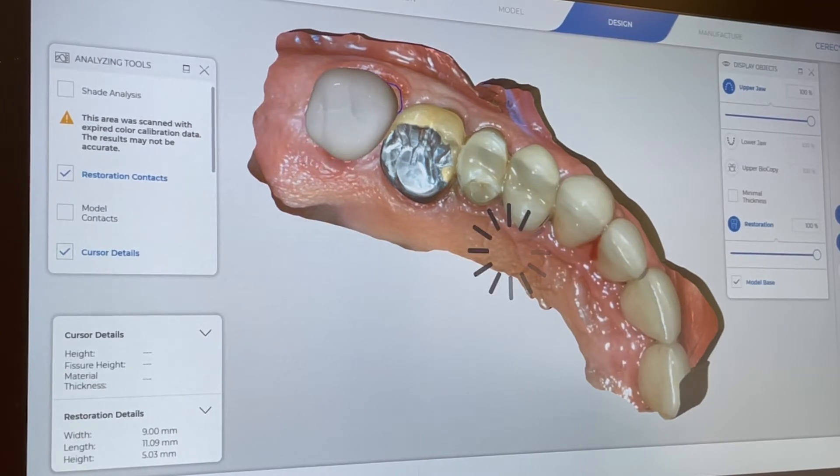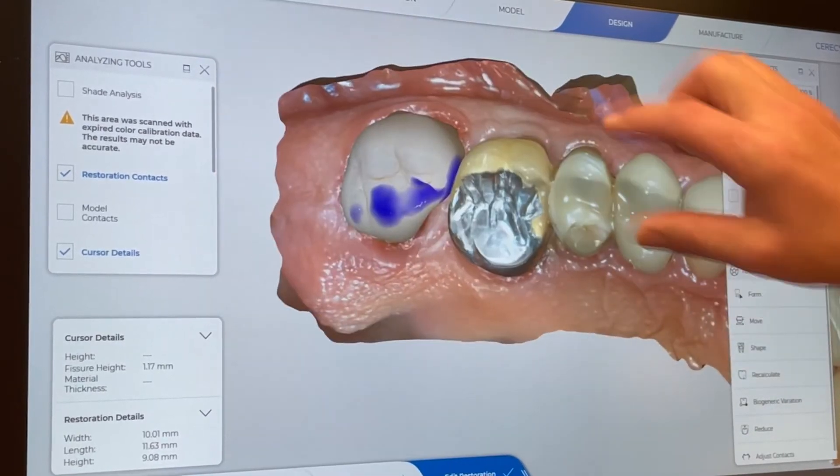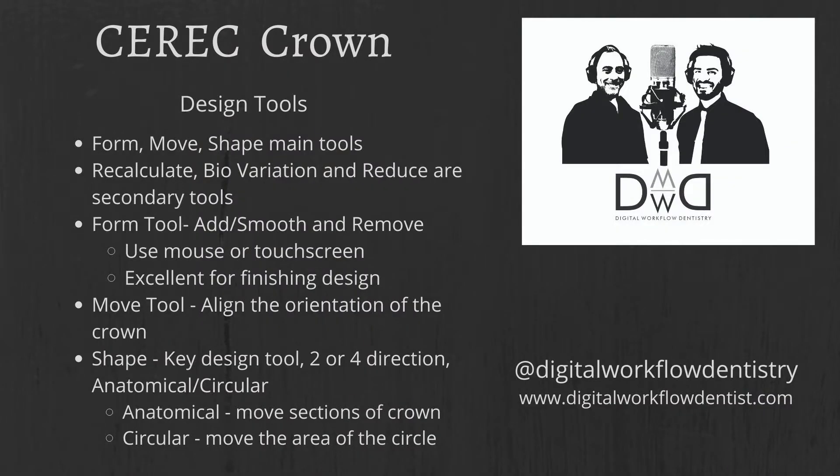Once we have the proposed crown we're going to get into our design tools. The main tools are the form, move, and shape — those are the three main tools used. Recalculate, bio variation, and reduction are secondary tools. The form tool — add, smooth, or remove — is excellent for fine-tuning and can be used with the touchscreen or mouse. The move tool aligns the crown in three dimensions, and the shape tool allows us to move the proportions of the crown either anatomically or circular.